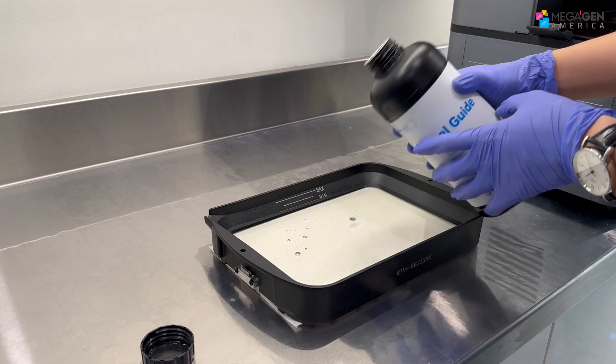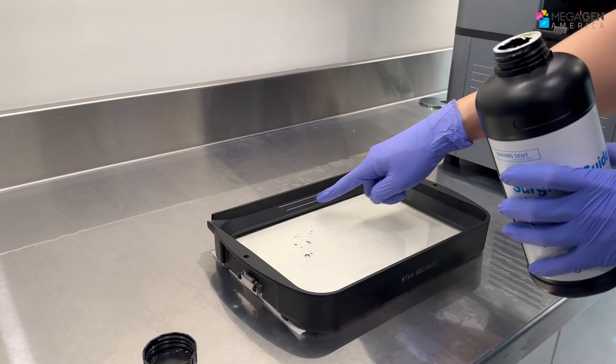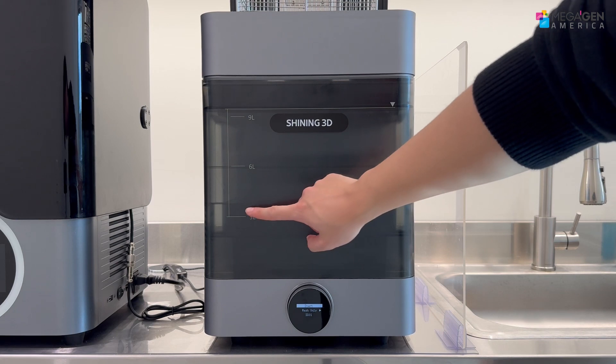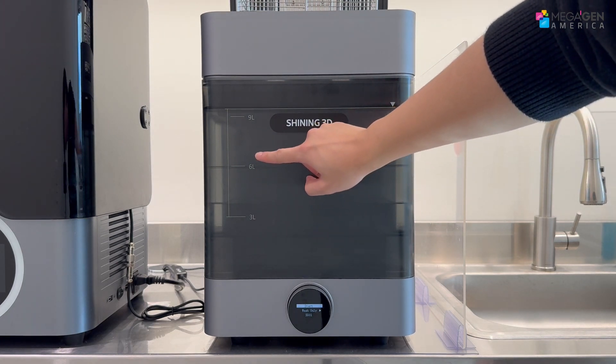Before we start, please make sure the surgical guide resin is poured into the resin tank. For the washer, add three to six liters of alcohol.